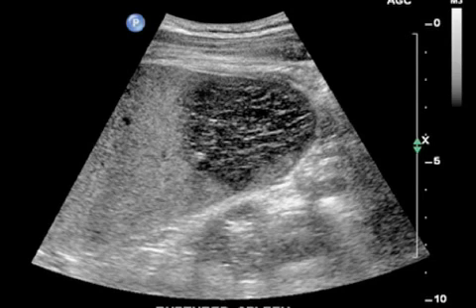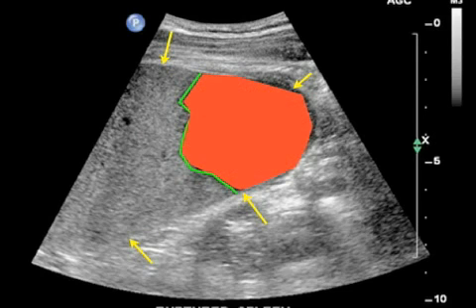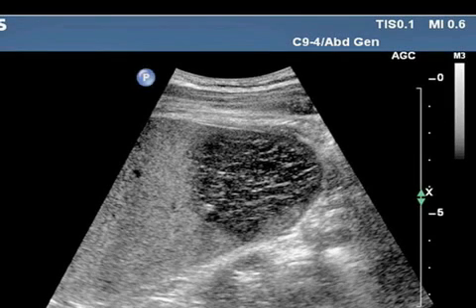These principles are demonstrated in this video, in which a ruptured spleen is diagnosed with ultrasound. Several things are obvious in this video. First, the border between the spleen and the normal parenchyma is easily identified. The demarcation between the normal parenchyma and the hemorrhagic tissue is obvious as well. This is secondary to the fact that ultrasound is reflecting at interfaces that have different acoustic impedances. When we remove the graphics, it is still very easy to see all the important areas of this ruptured spleen. Again, this is because of the great difference in acoustic impedance between the various tissues.